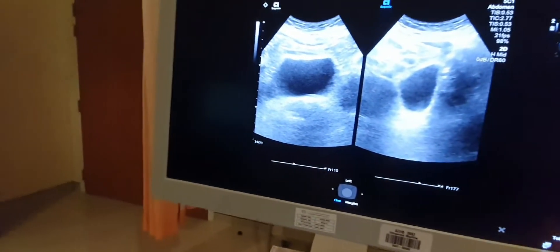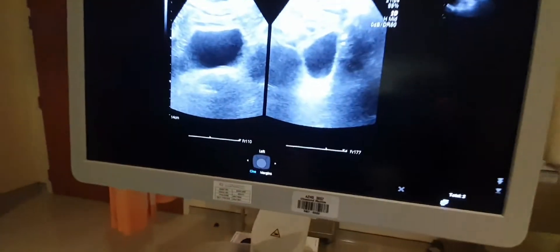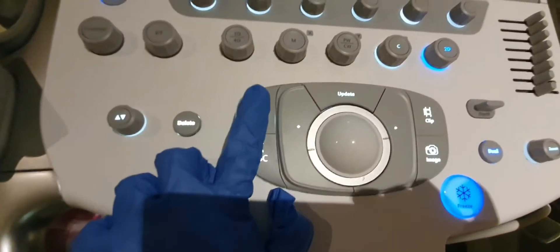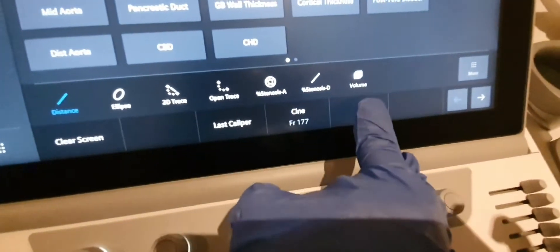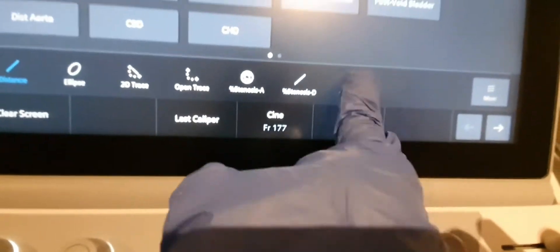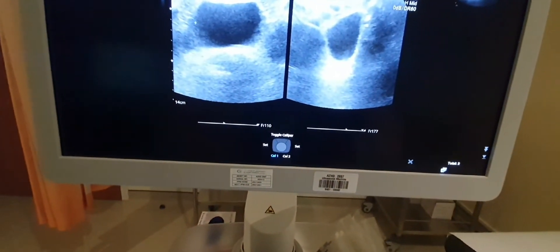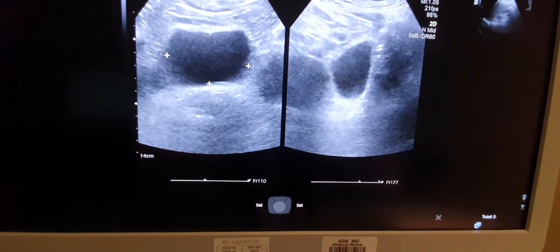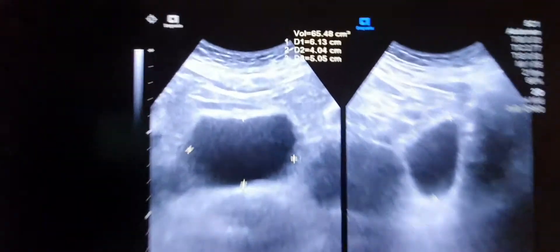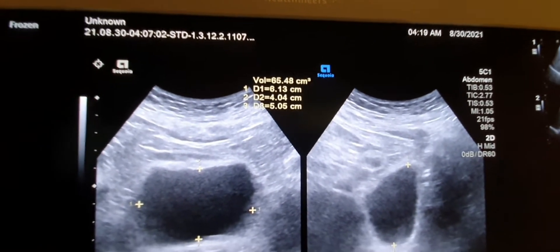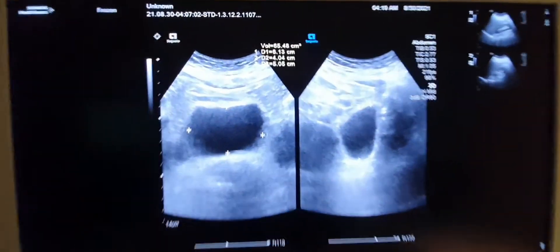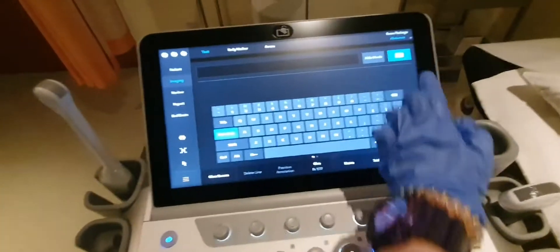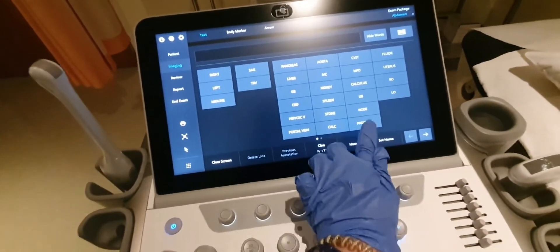This is my urinary bladder. To measure the volume of urine inside, select caliper, then change from distance to volume. Place the measurement points and the system calculates the volume automatically. My bladder volume is 65.48 cubic centimeters.